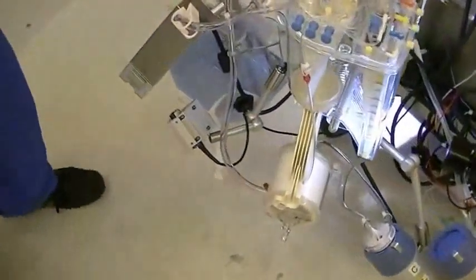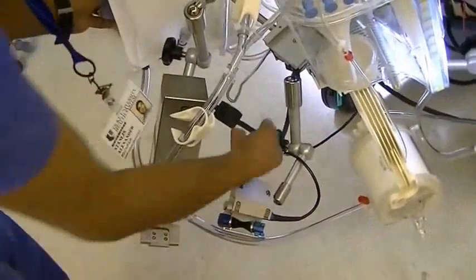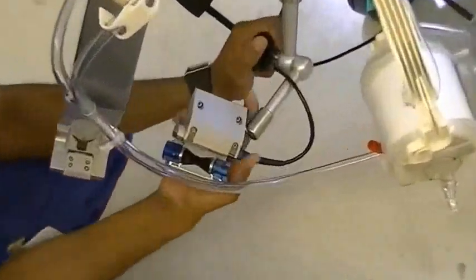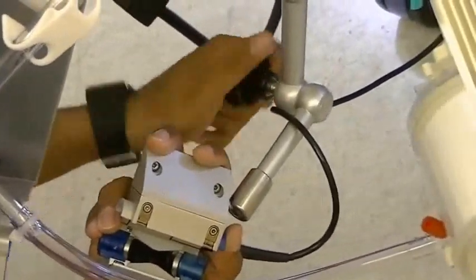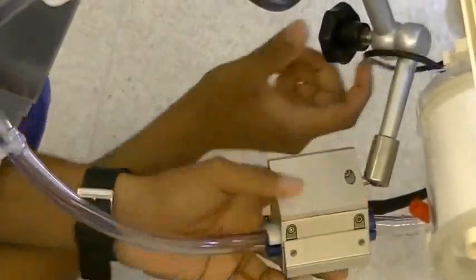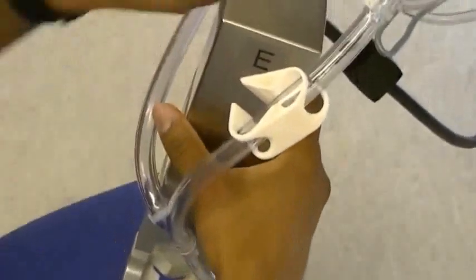Next we can actually load this tubing into our bubble detector and our E-clamp. Whenever you remove either the E-clamp or the bubble detector, make sure to loosen the holding here. That will give you a little more freedom to move it around without damaging the holders, and then tighten up. The bubble detector goes first, then after the bubble detector will be the E-clamp. Loosen it before moving it.